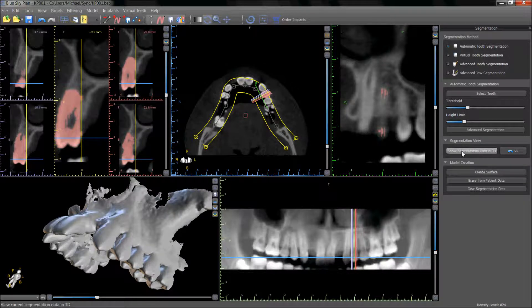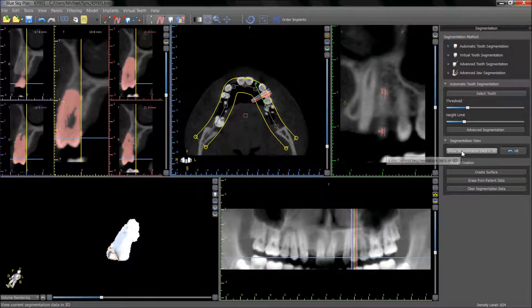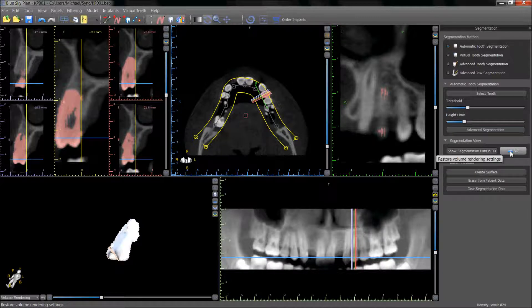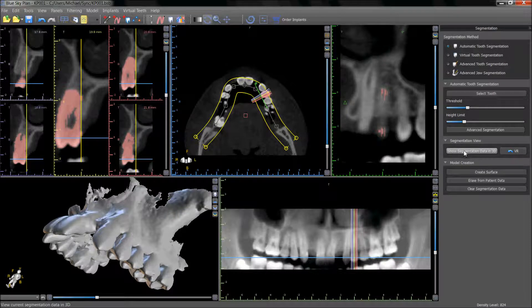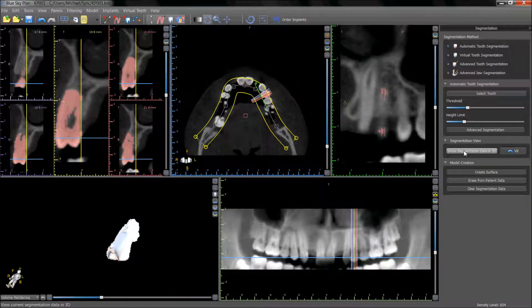Pressing show segmentation data in 3D will preview the segmented tooth. Pressing VR volume rendering will once again return to the full volume. Changes to the threshold and height limit can be made and show segmentation data in 3D can be pressed again to preview the changes.